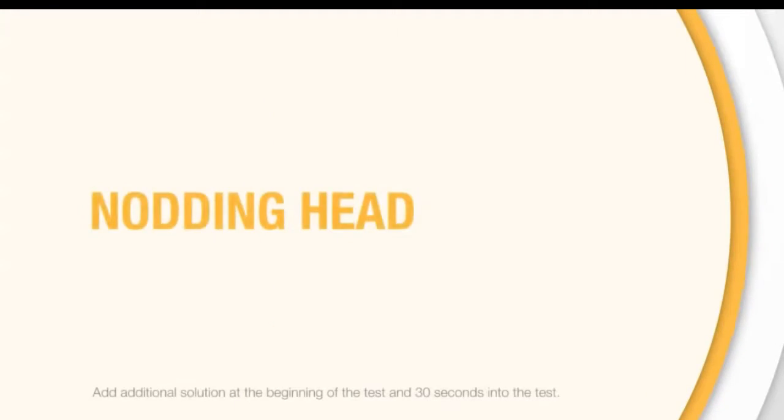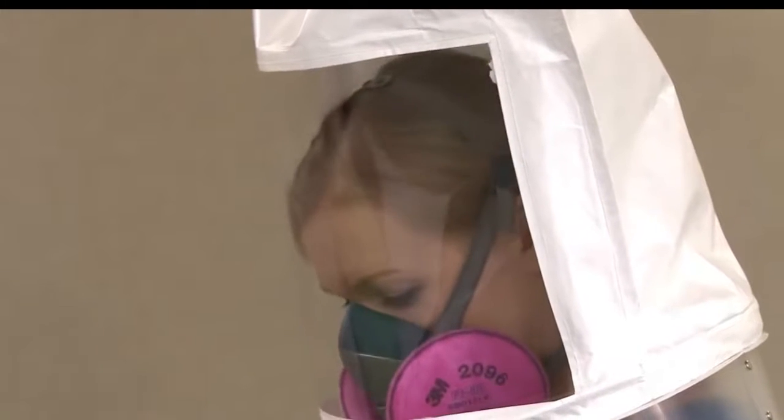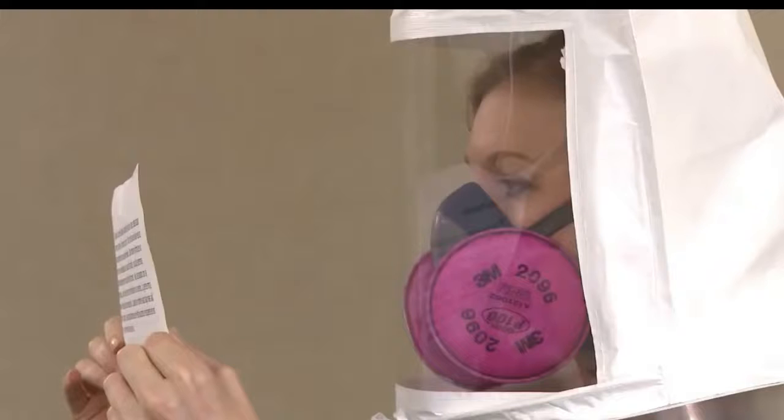4. Nod your head up and down, holding at each position for 1 or 2 breaths. 5. Talk. Read the rainbow passage slowly out loud.